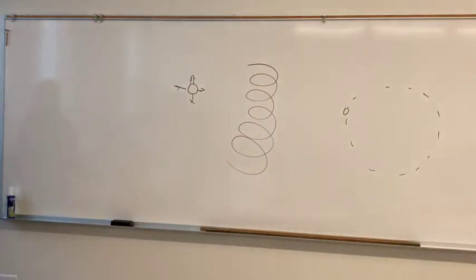But there had to be four things present. You had to accomplish four things to make that happen. Well, really you only had to have one thing, and that was a changing magnetic field. We'll talk more about that here in a bit. But he also found that the amount of electricity that you created was dependent on four things, and those are the four things that you see on page 78.